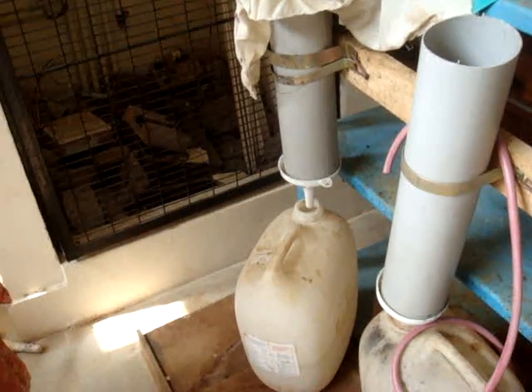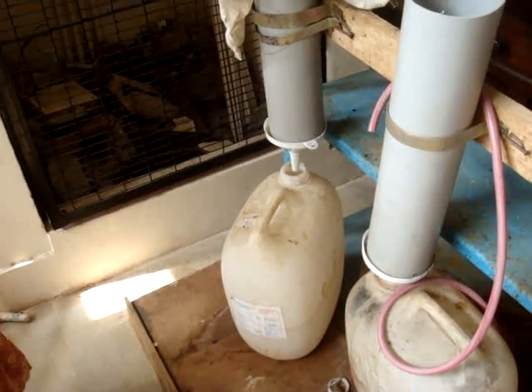And how are you going to check that? So at frequent intervals I am collecting samples and doing analysis. Okay. And then after this filtration, what will happen? For the pathogen load, I send the sample to the Salem Biomedical Research Foundation Department to check whether it contains any harmful pathogen: Leptospira, Salmonella and Shigella. These three microorganisms we are going to identify in the sample, whether it is contaminated or not.